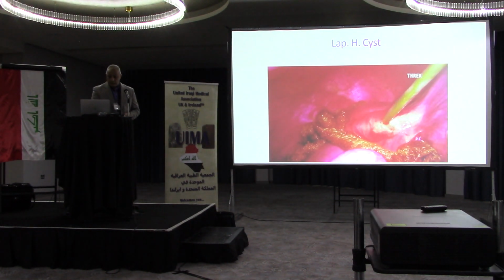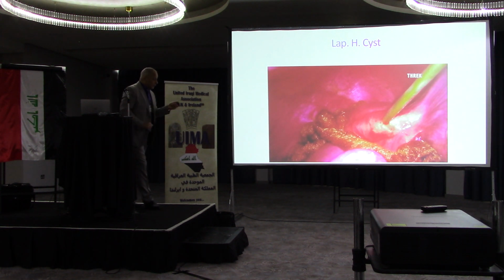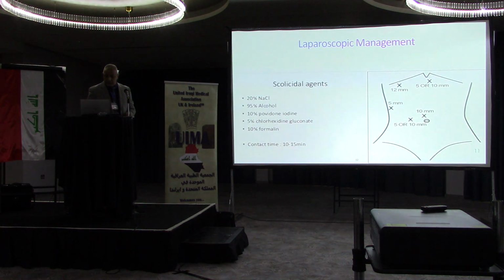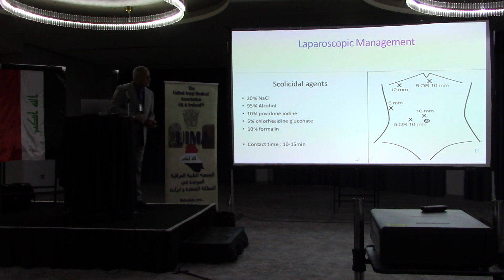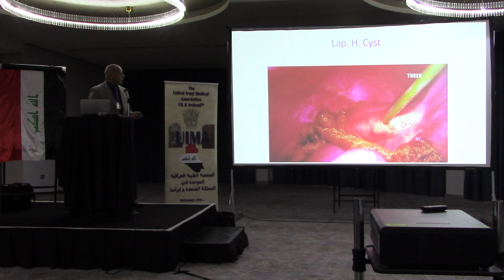Usually they start with this. What I do, starting with the positioning of the patient. As you see in this picture, they usually do it with more than 4 or 5 ports. What I do really is with 3 ports, and I will show you the procedure.